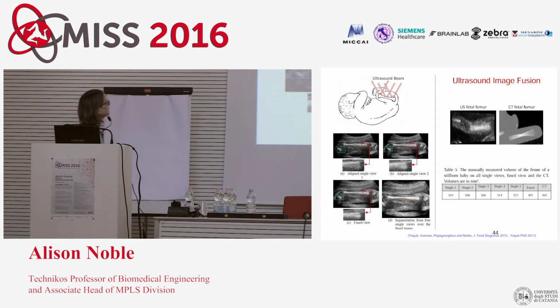You can do the same thing for fetal ultrasound. The problem here is your little object likes to move, so you have to pin it down. Here was an example where we were very interested in characterizing what goes on at the end of the femur. It was part of a large vitamin D study where the growth at the end of bones was very important. And if you look at it in a classic ultrasound, it all sort of fades away. So what we did was we took multiple scans, fused them together, and then compared, and here you've got a better quality, slightly visually better reconstruction.